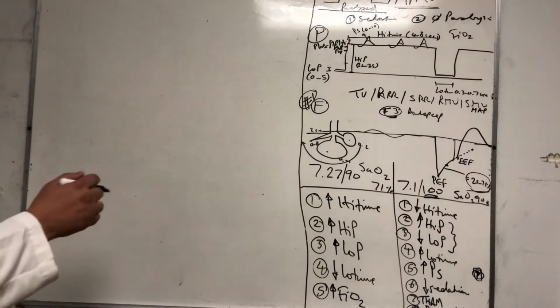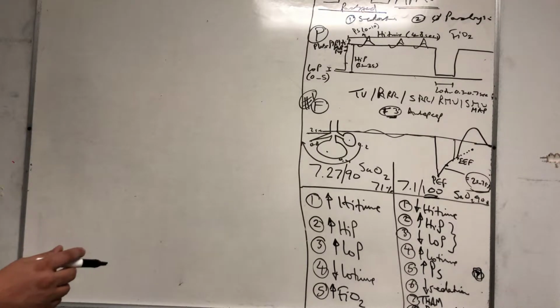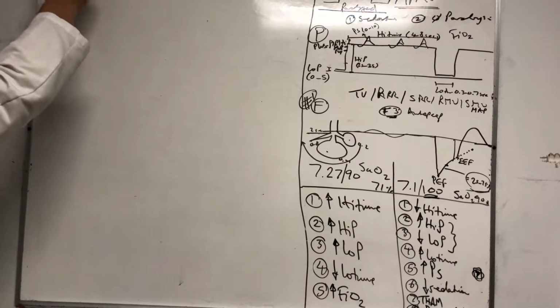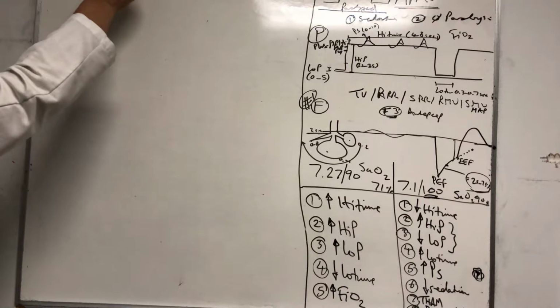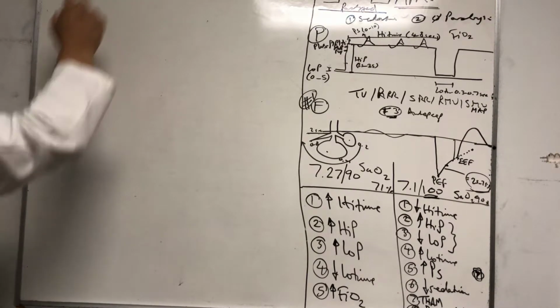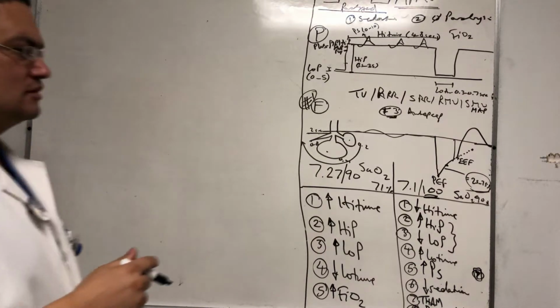That's great, right? Anyway, so let's talk about weaning of APRV. So there's two methods of weaning. One of them is called drop and drag. Be careful, you say this word only in the hospital, okay?